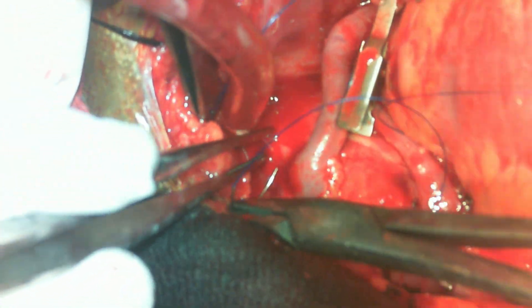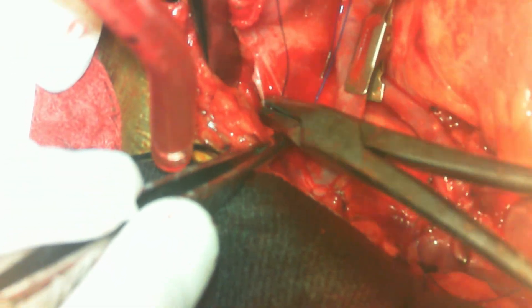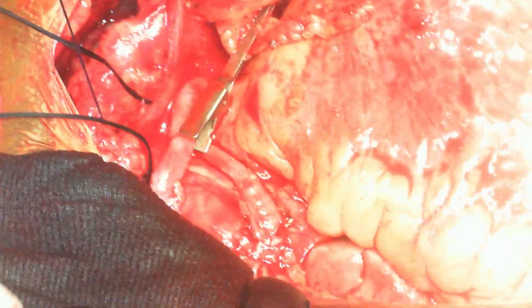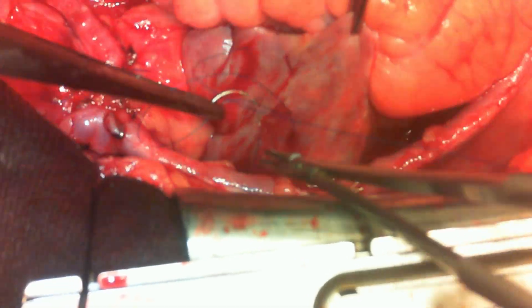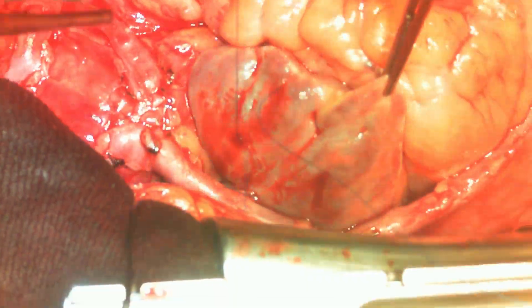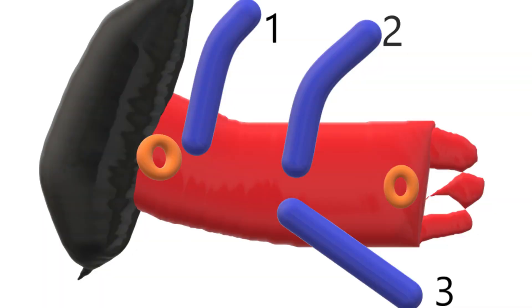Accordingly, a purse string is taken at the top end of the aorta, and you can see the graft to the OM1 sitting quite nicely. Since we have time and the hemodynamics are stable — no embolism from the mist blower — a purse string is taken at the top end of the aorta with no bleeding from the perforation site. Then take a generous, large oval purse string on the right atrium so you can open the RA in the center and smoothly place the atriocaval venous cannula or two-stage venous cannula.